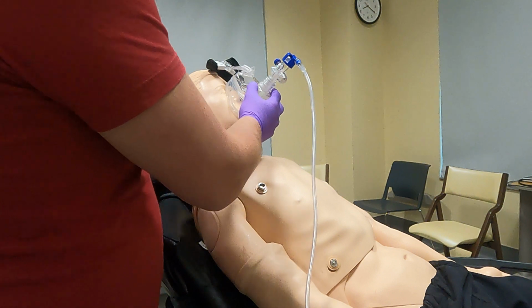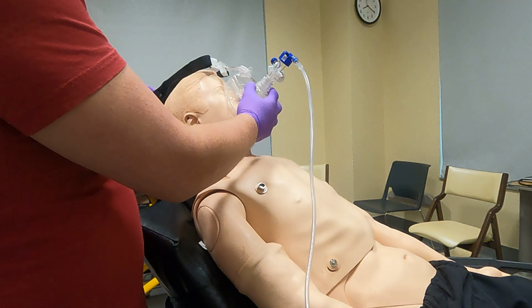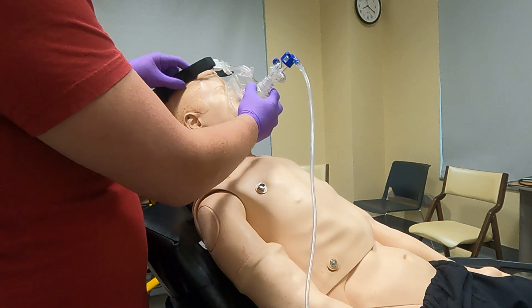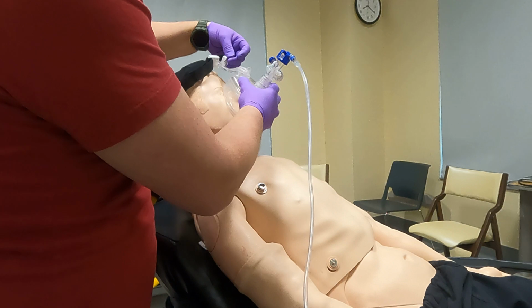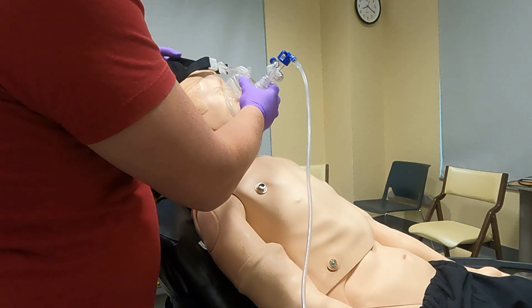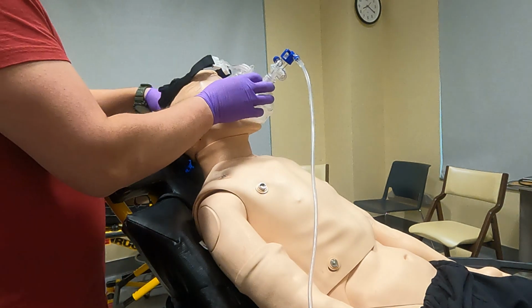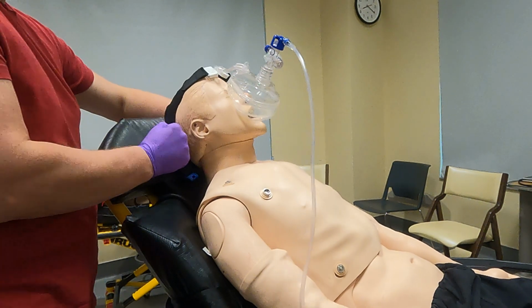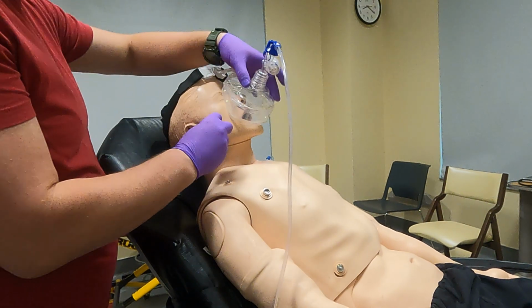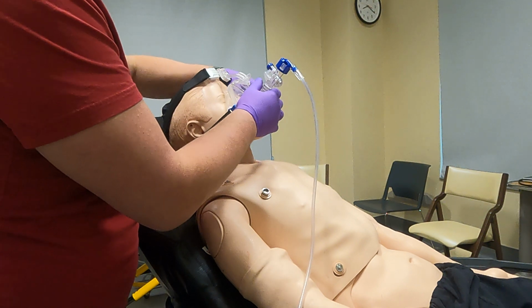All right, so are you feeling comfortable with that? Is it okay? And if he says yes, it's helping, then we can start to work on securing this to our patient. My head strap is backwards. There we go. So I'm going to tuck this around behind his head here. These just clip on like so.